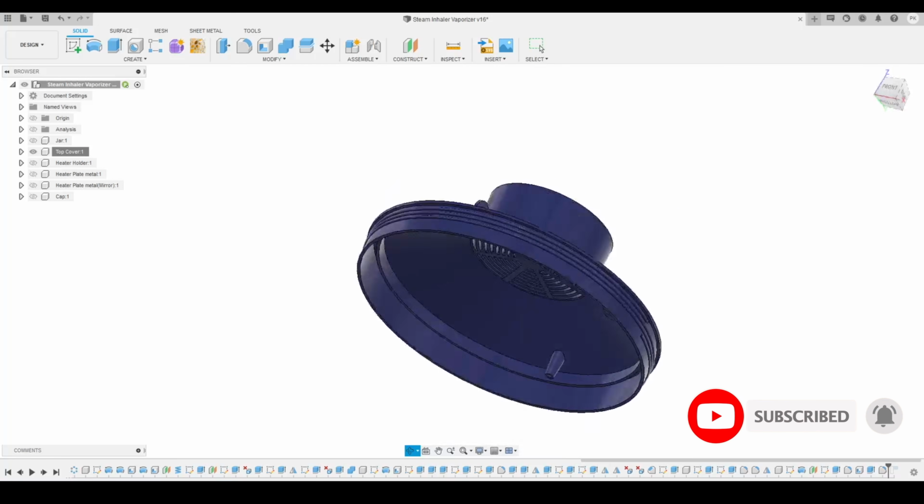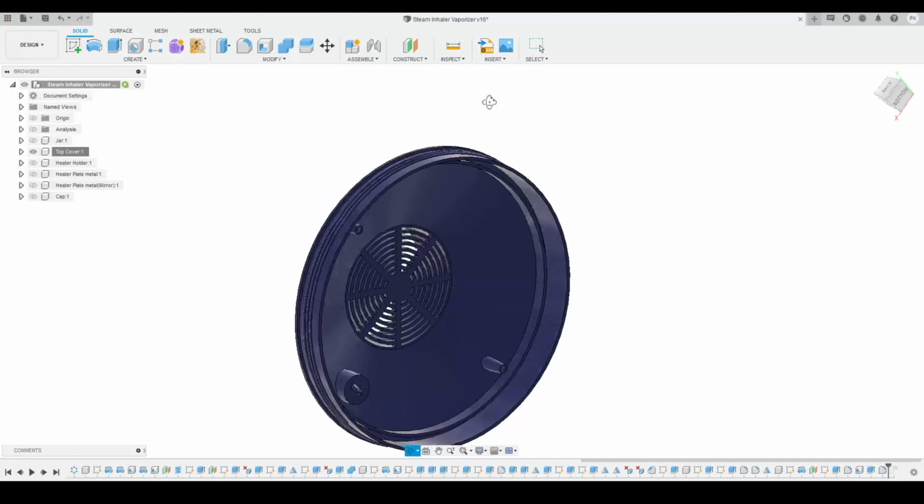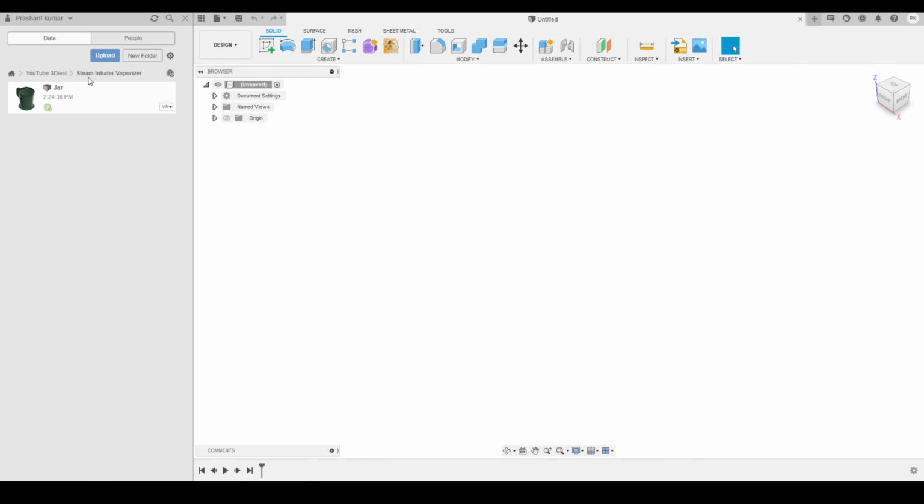So without wasting much time, let's dive into Fusion 360 and start modeling our top cover component. So now we are in Fusion 360, and before getting started, I'm going to make a small change over here. Here you can see inside this data panel, inside our YouTube project folder, we had created this folder, and inside this is our file, this jar file.